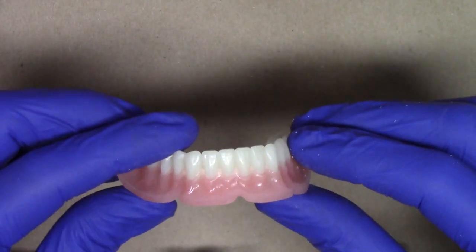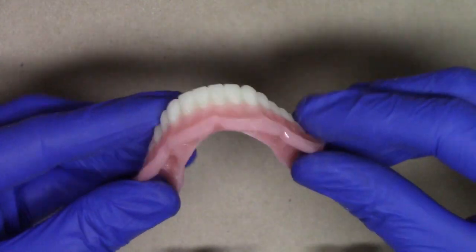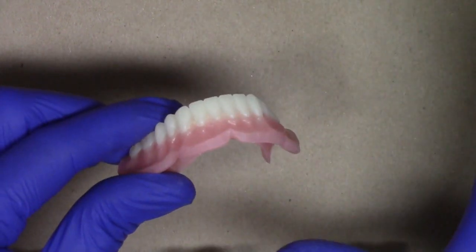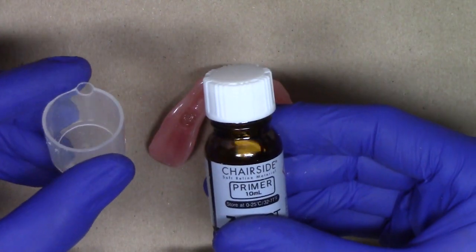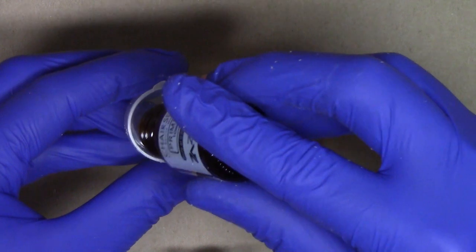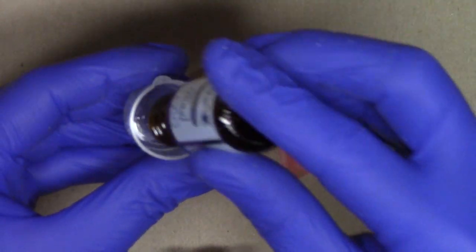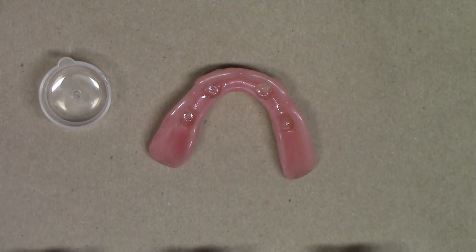So now once I've finished with my beveled edges, I just take a little bit of air and dry off the entire denture. Sometimes you have to run it underneath some water just to ensure that all of the dust has been removed. Now the important step is that we're going to take our CHAIRSIDE primer and place a few drops into this dish. Just lean it at an angle, and you don't need a whole ton, because what's important is you want to use the right amount of primer, not too much.